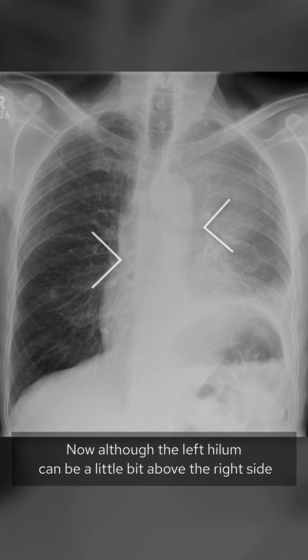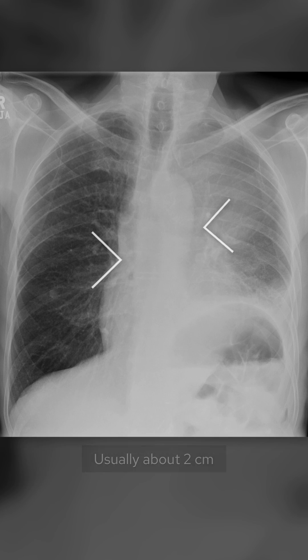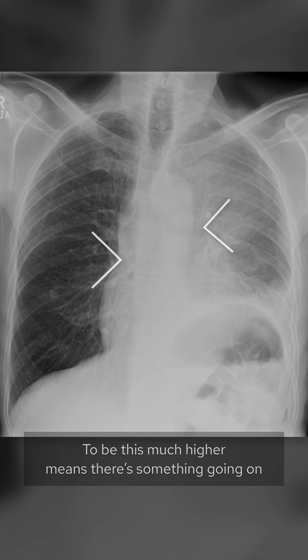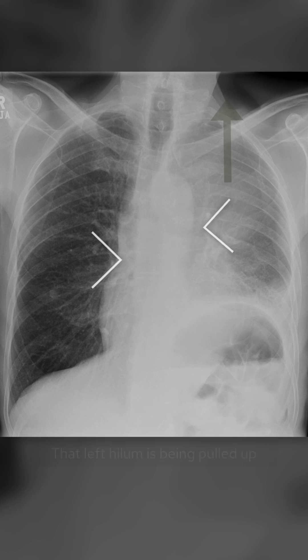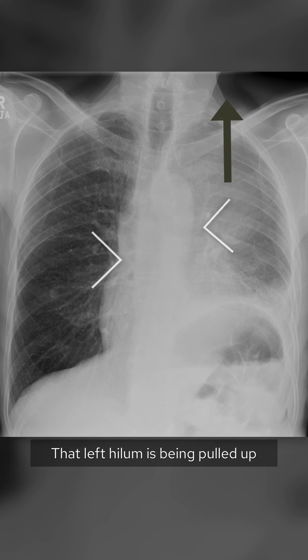Now although the left hilum can be a little bit above the right side — usually about two centimetres — to be this much higher means there's something going on. That left hilum is being pulled up.